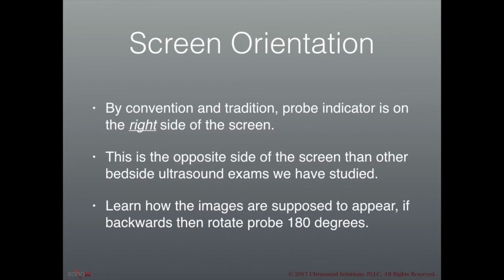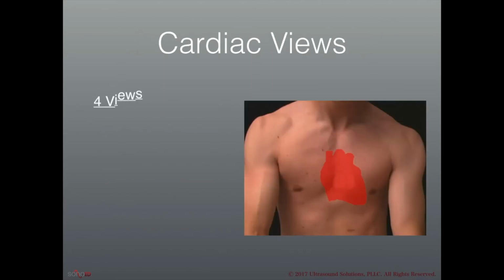So basically, I'll teach you the theory behind this, and I'll teach both approaches, but really it's best to learn the underlying rationale and how the image should look on the screen, so that no matter whether you pick up a machine with the indicator on the right or the left side, you can make sense of the image that you acquire. All right, hopefully that wasn't too confusing. So let's move on now to the actual views that we're going to obtain and where we're going to place the probe on the patient's chest.